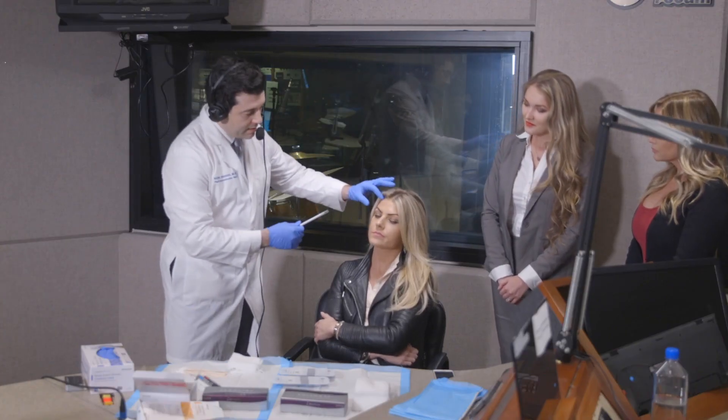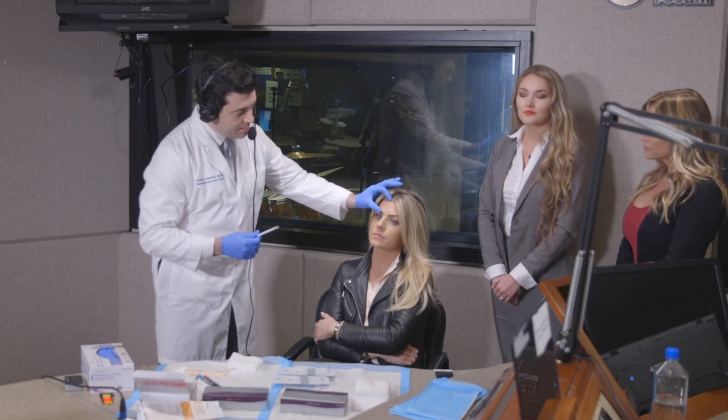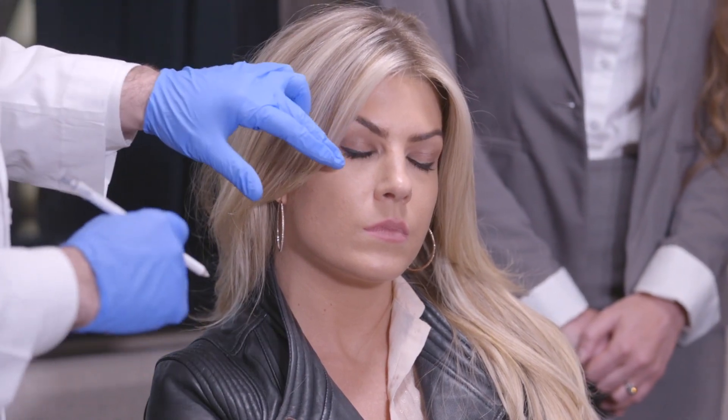We're going to start by doing a patient assessment. When we analyze a patient's face, we usually start from top to bottom in a very systematic fashion. We start by splitting up the face in thirds: the upper third goes from the hairline to the brow, the middle third is from the brow to the base of the nose, and the lower third is from the base of the nose to the chin. As we age, a common location where we lose volume is in the cheeks, and as we continue to lose volume, the ligaments start to sag.